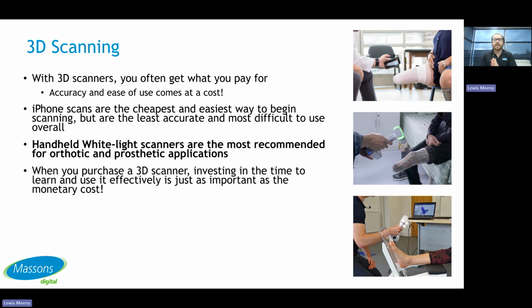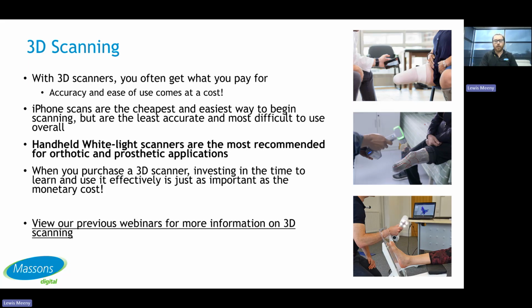When you do purchase a 3D scanner, like we'll reiterate constantly, investing the time to learn and use it effectively is just as important as how much it costs you. We don't want this to be an expensive paperweight. You want to buy a scanner and put the time into using it to the point that you should be able to scan like it's second nature to you, just like your hand casting. If you want more information on 3D scanning, you can view some of our previous webinars where we've covered this topic in more depth. It's available through the Massons Education portal or directly on our YouTube channel.